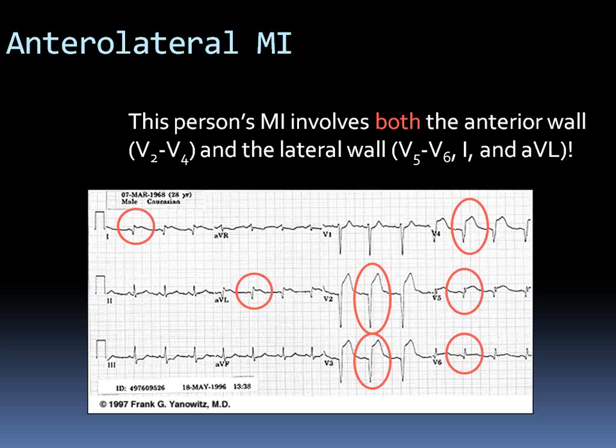All right, guys. Did you guys think about what you want to do, or you guys are okay with us proceeding? I think the heart blocks are still a bit unclear. And I'm having issues differentiating between fibrillations and flutters. Okay. Yeah. So we can go over that again. Okay. And Fatima says we need to put in more practice strips.